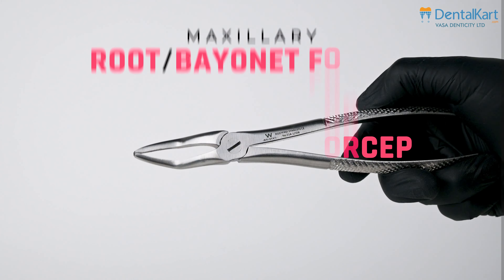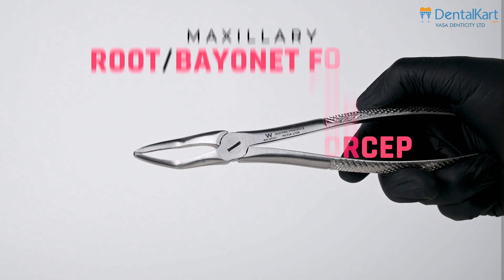The maxillary premolar forcep extracts the first and second premolar on both sides of the dental arch. These forceps feature a slight S-shaped design with smooth concave beaks that firmly grasp teeth for removal.